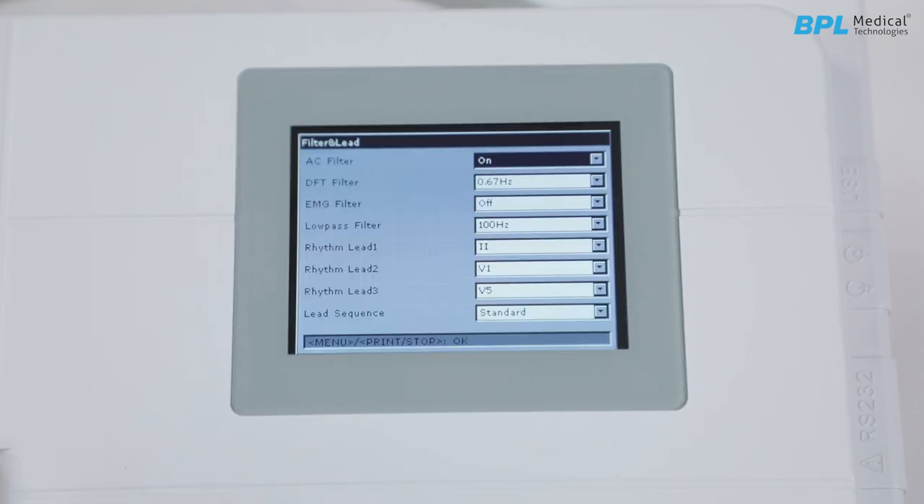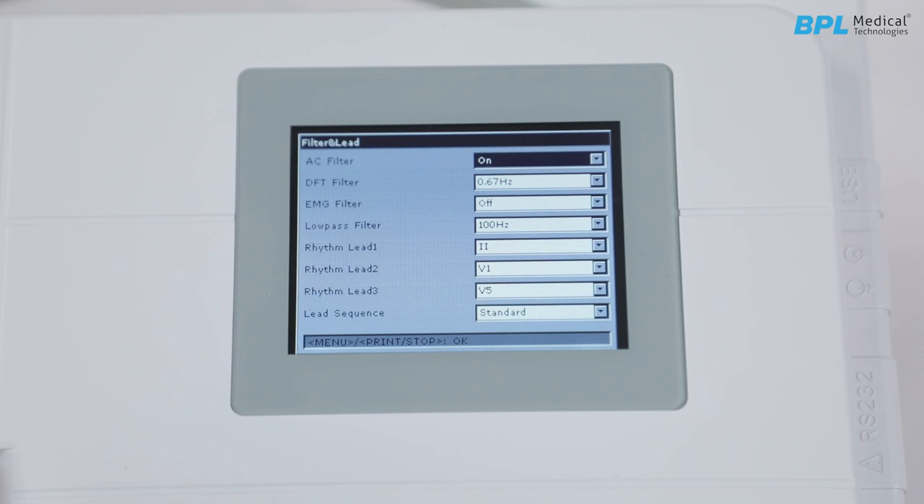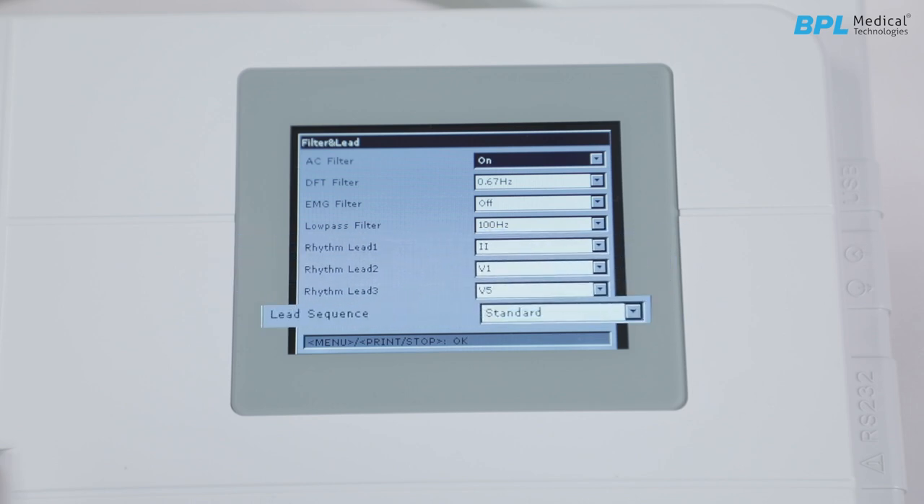Filter and lead setup. AC filter is mainly used to reduce noise or interference. DFT filter reduces baseline fluctuations. EMG filter is used to suppress disturbance caused by strong muscle tremor. Low-pass filter restricts the bandwidth of the input signal. Then we have the rhythm lead selection and lead sequence, whether standard or Cabrera.